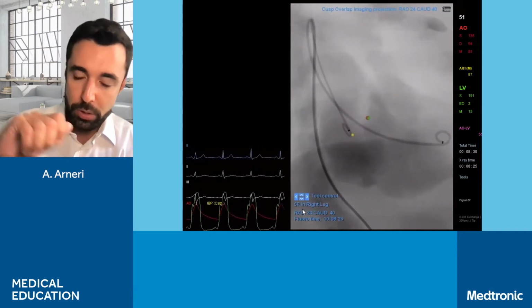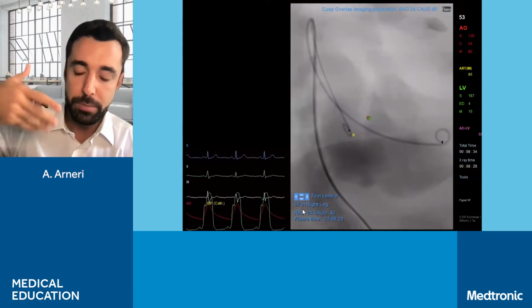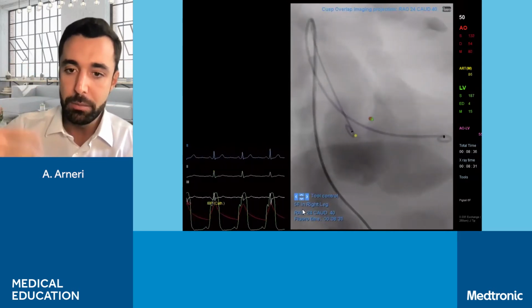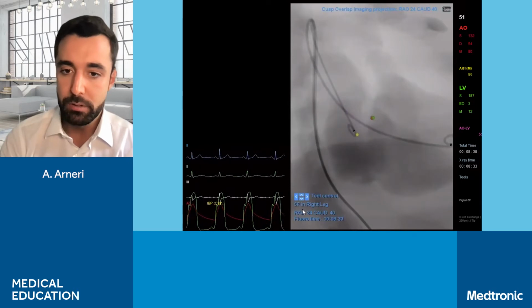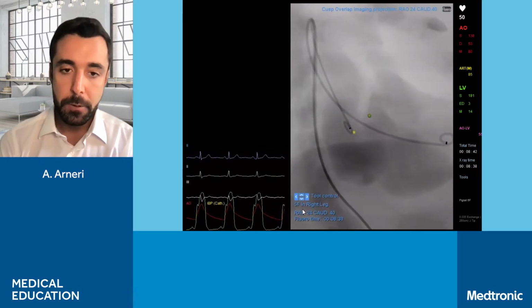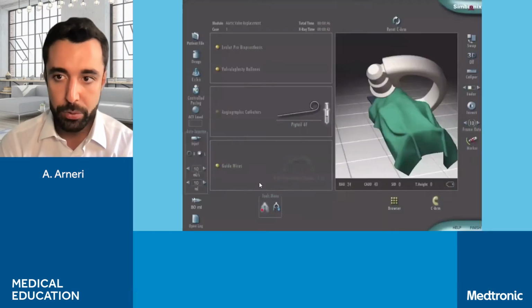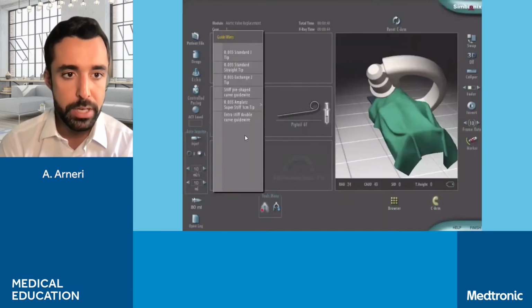Maybe George, at this point, you can rotate the pigtail. And if the pigtail is freely rotating in the ventricle, that means that we're not stuck in the mitral valve, which is a really good sign before insertion of the pre-shaped guide wire. So now we want the pre-shaped guide wire in the ventricle. We're going to choose a Confida pre-shaped guide wire in this case.